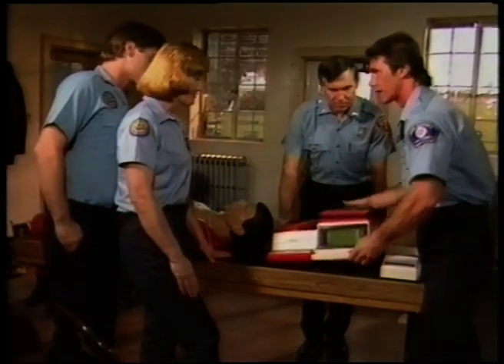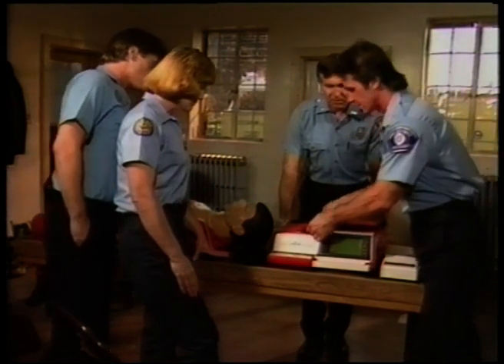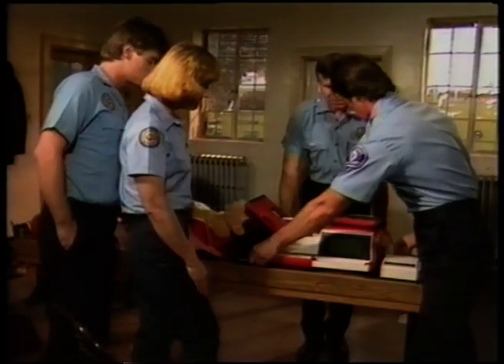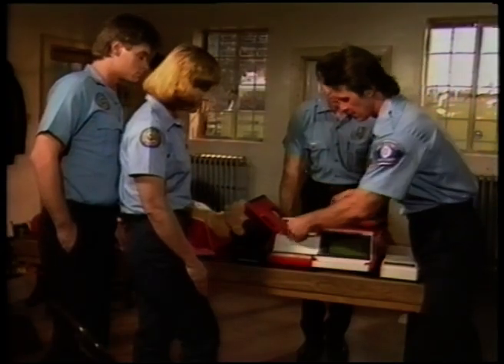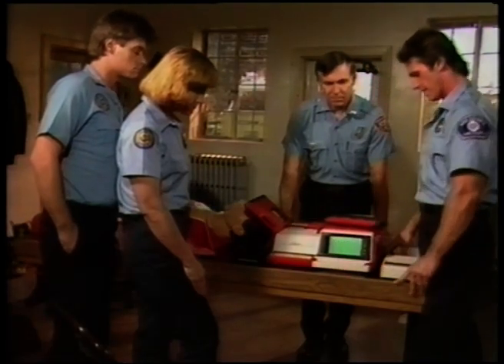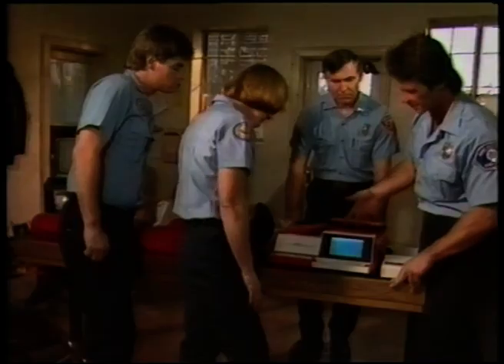Before you begin, remove the cassette tape and replace it with another tape designated specifically for testing. Since the LIFEPAK 300 has no rewind capability, this avoids filling the tape with operational test procedure data and ensures that the original tape will be ready when the device is used on a patient. Turn the unit on. Wait briefly for the self-test procedure to complete and connect electrodes begins to flash. Ensure that the cassette tape is turning by peering in the observation window.